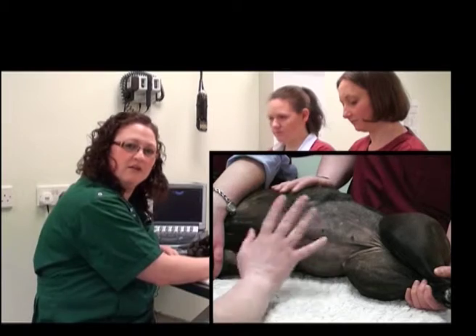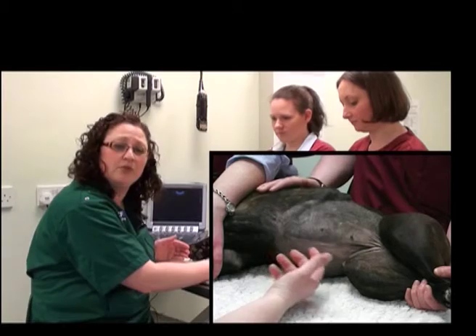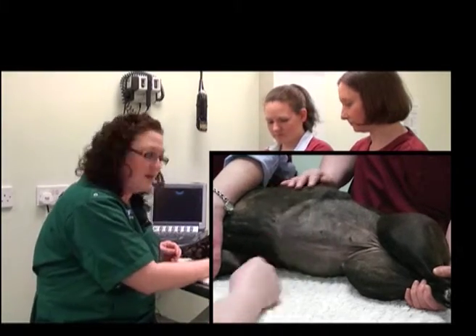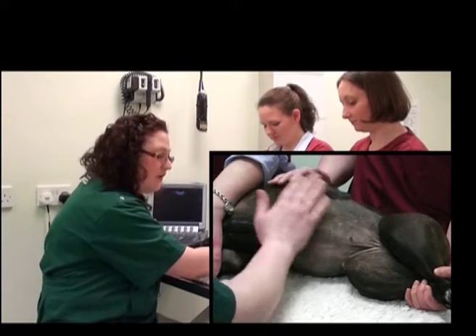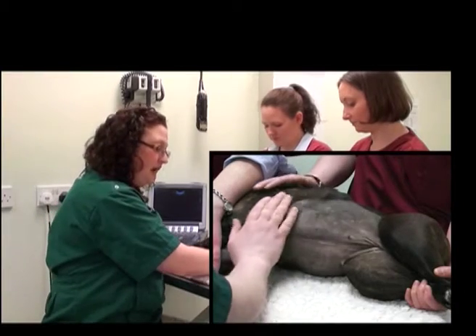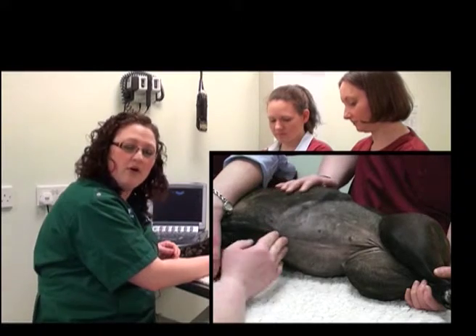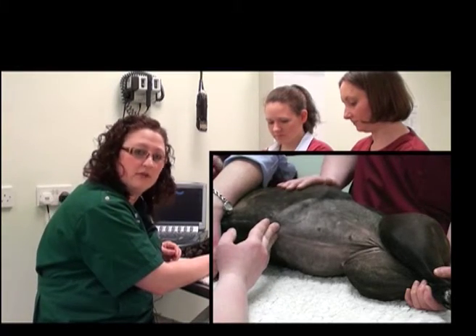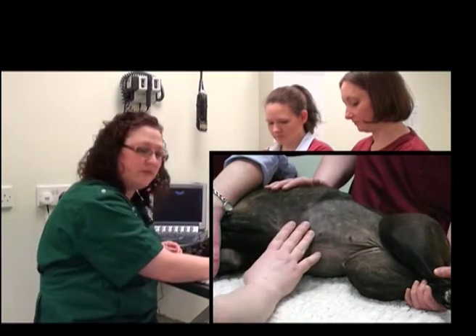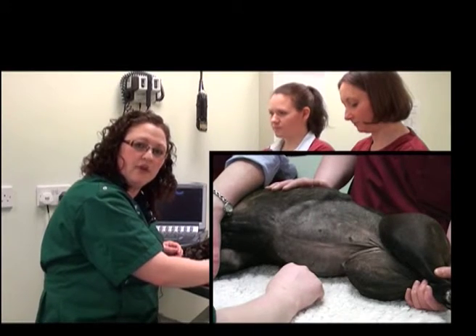This is because air is an enemy of ultrasound. It will really cause your image quality to be very poor if the coat is very thick or there's a lot of air trapping there. So ensure that you clip a nice large area. When performing a full ultrasound examination of the abdomen, you'll want to continue your clip all the way cranially past the xiphisternum, along the rib cage, and actually halfway up the side of the ribs on the lateral side, and all the way caudally to include the urinary bladder.